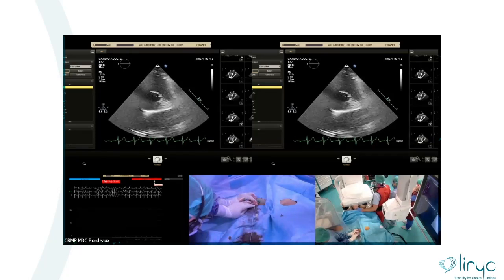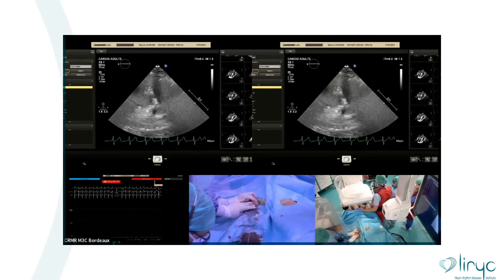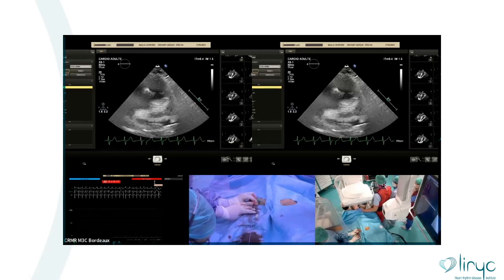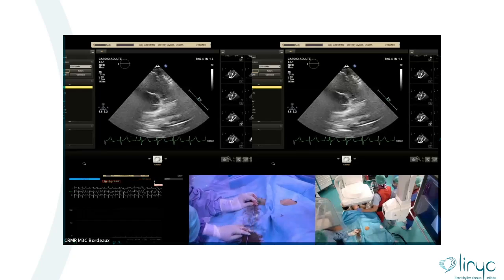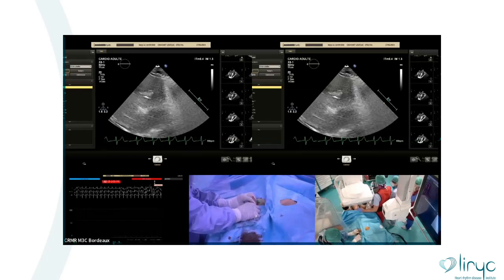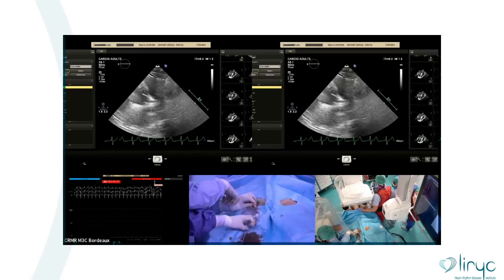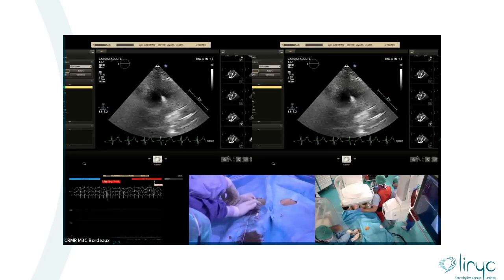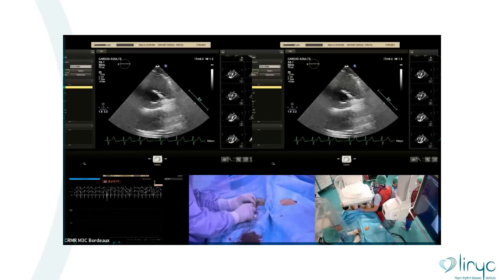You can still find the wire, right? You should catch the wire. We are very far. We measure again. We can use hand: 1, 2, 3, 4. Okay, four fingers. Hold the guide wire. Yeah, you can take everything out. Okay, good job.